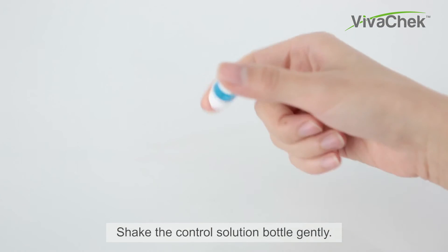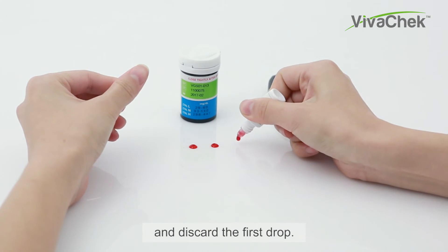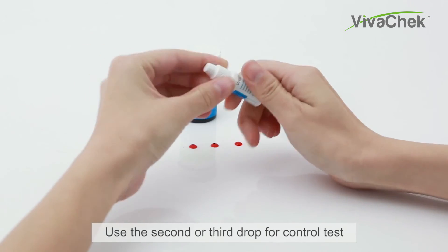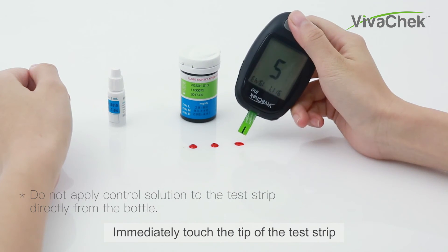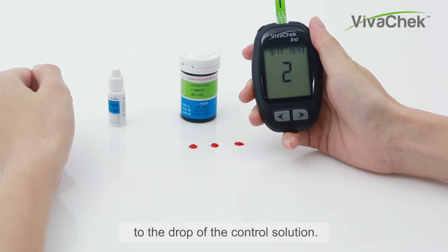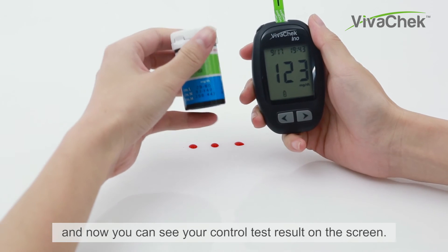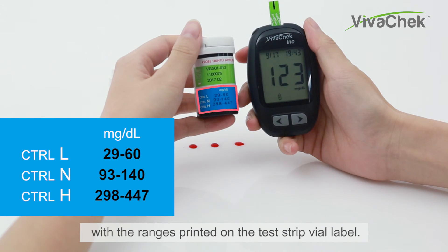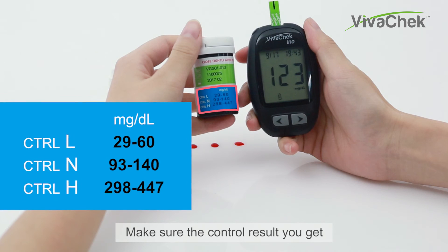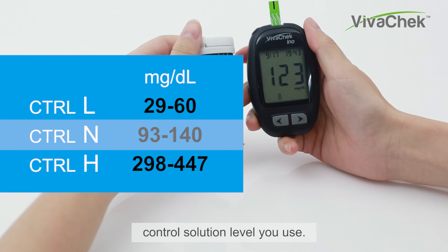Shake the control solution bottle gently, then squeeze it gently and discard the first drop. Use the second or third drop for the control test. Immediately touch the tip of the test strip to the drop of control solution. The meter will count down from 5 to 1, and you can see your control test result on the screen. Compare your control test result with the ranges printed on the test strip vial label.